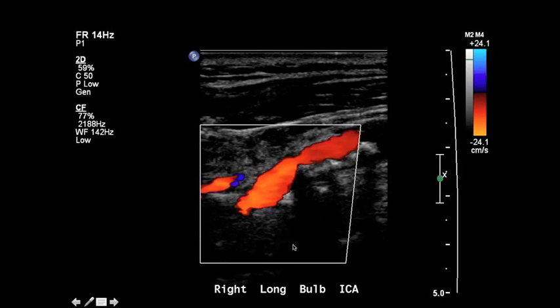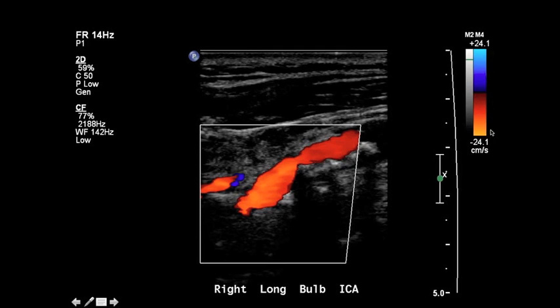One of the first things you have to look at to determine whether things are moving towards or away from the transducer is the direction that the box is steered. The color Doppler box is demonstrated by this white line here, and you can see by this edge that it's actually steered to the left. Blood flow in this patient's carotid is going towards their head, which is away from the transducer, and therefore it's encoded in red and orange.